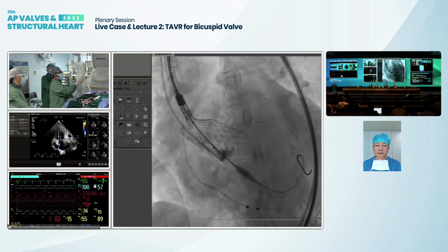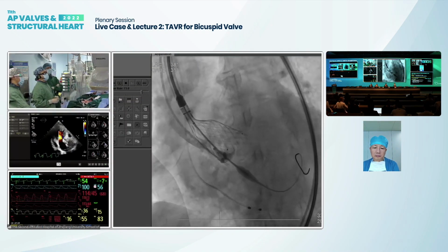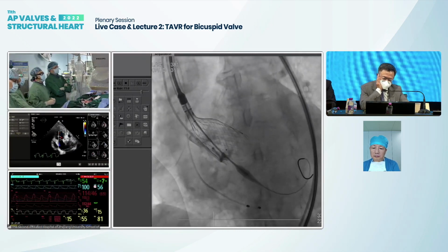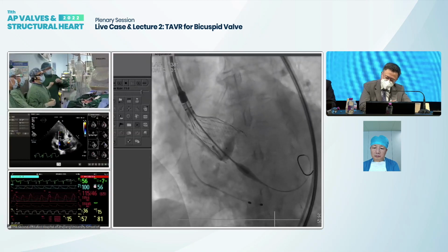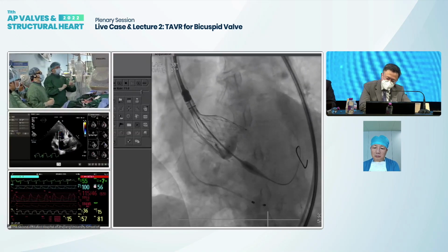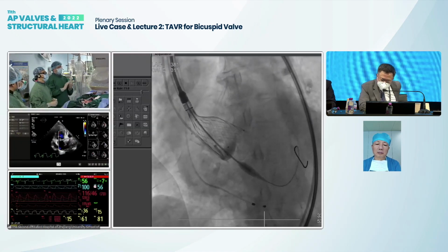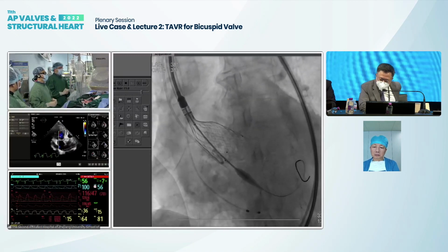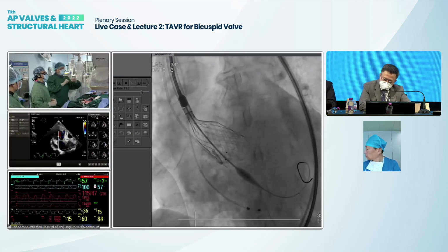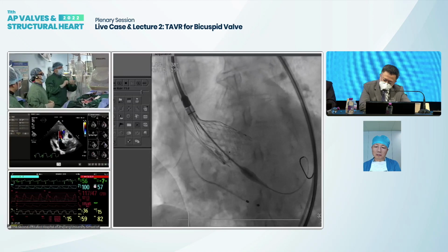Yeah. This is the left side. Looks quite good. It seems like this time the catheter is more on the outer curvature of the aorta than the last time. Yes, we pushed the device a lot. We kept the force pushing forward of the device during the releasing. You know, we were so worried about the device pumping out. So we kept the tension, pushing the device forward while we were releasing.